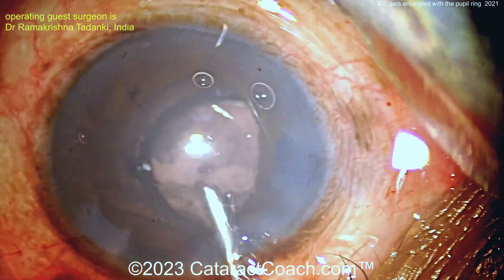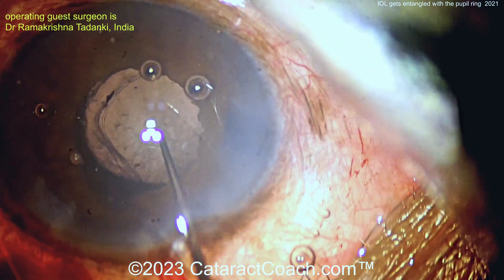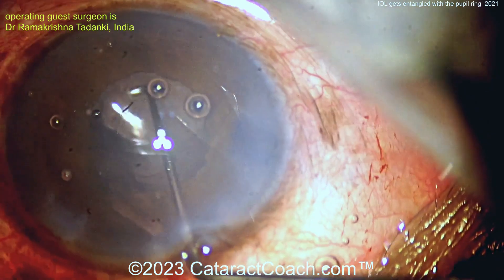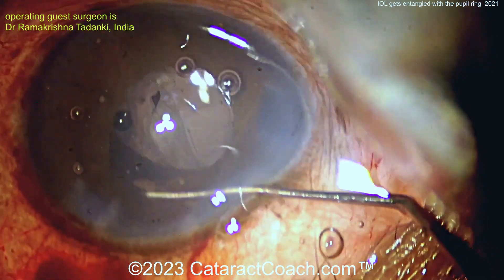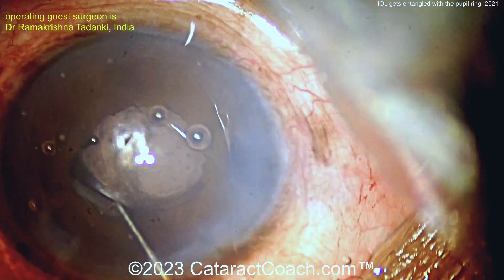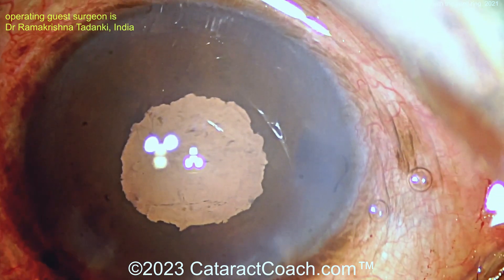The danger here is you just say, well, I'll just dial it in, and you put it behind the iris with one haptic in the sulcus and one in the bag — that's going to be a bad recipe. You don't want that. Get that lens in the bag. That trailing haptic that's on top of the iris needs to go in the bag. Then use the chopper or Sinskey to lift up the iris to confirm it's totally in the bag, and the patient will have a nice outcome. Good save. Thank you for the video.